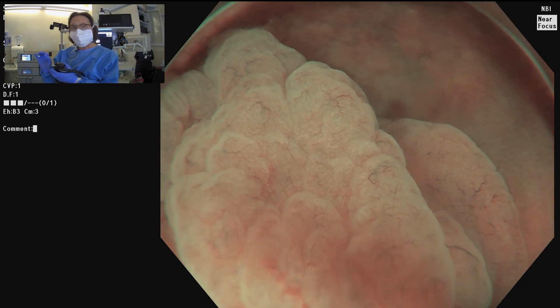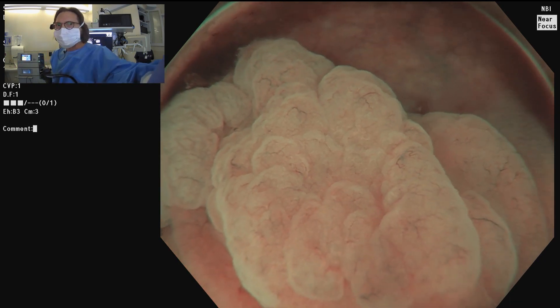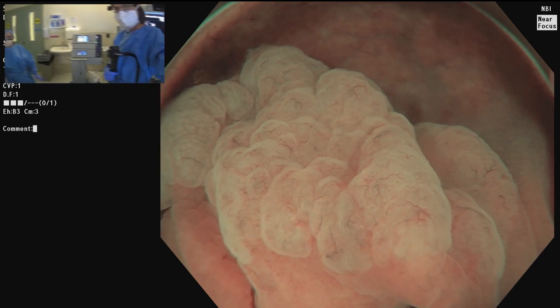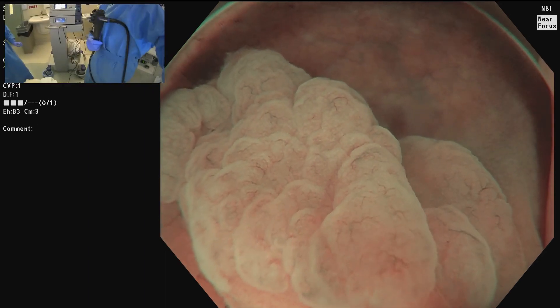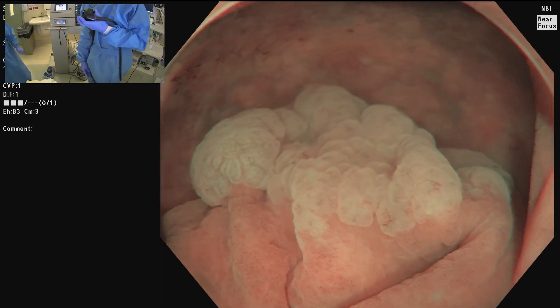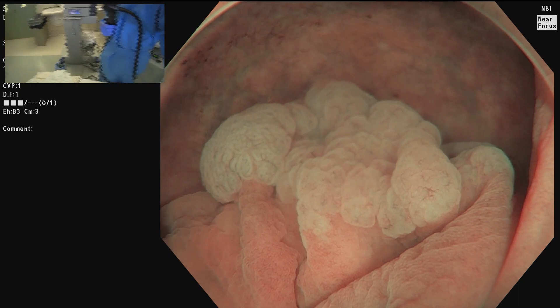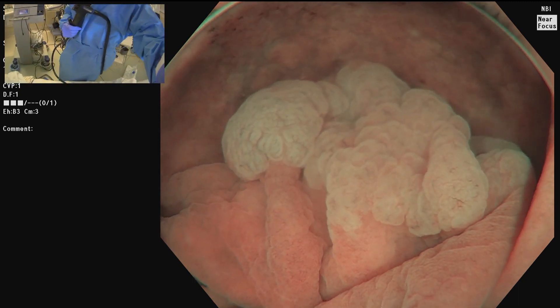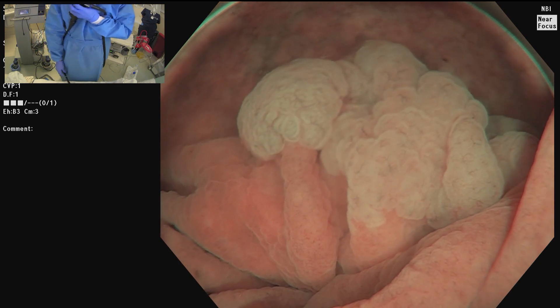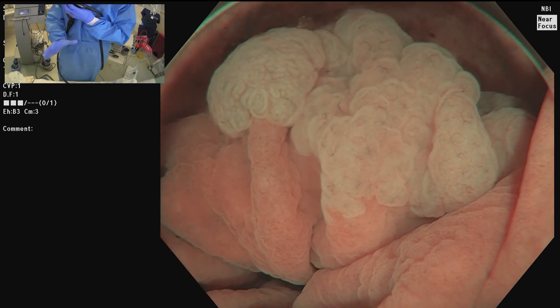We're going to use soft coag. Jeannie is right next to me here, and I want you to give me the snare — we're going to use a 33 mm snare, the largest we have. A second nurse will hold the scope and position.